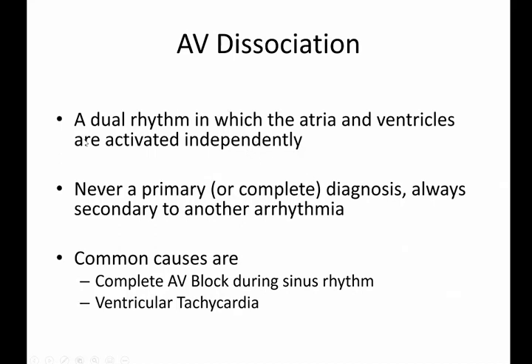Now remember, a very important point in this talk is that AV dissociation is never a primary diagnosis, and it is always secondary to some other basic arrhythmia or rhythm disorder.